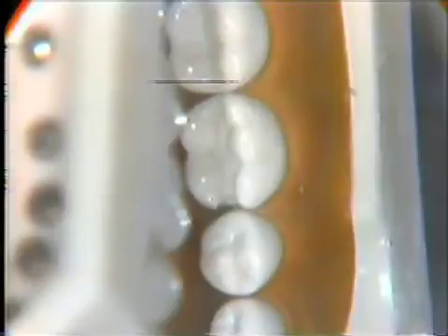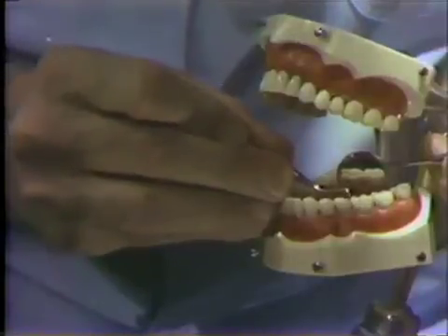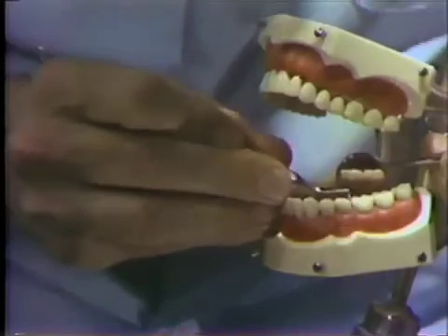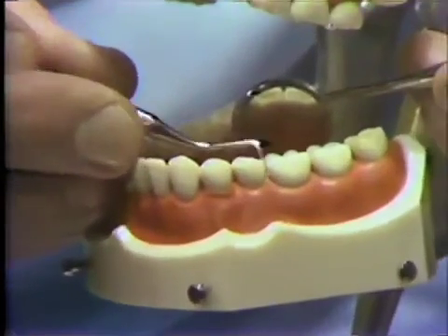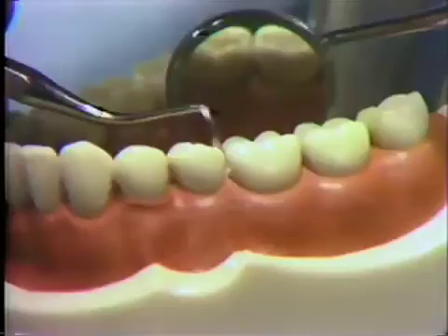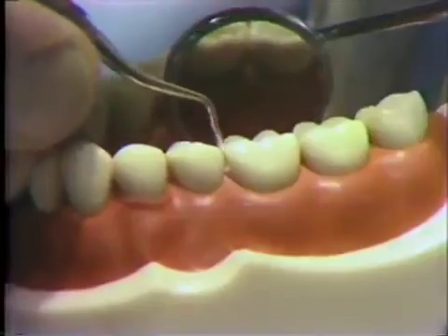With the T1 instrument, the gingival trimmer, we refine the cervical cavosurface area, cleaning up extraneous enamel rods, sliding down the lingual proximal using a lateral scraping action and a pen-type grasp. This is a modified bevel, the intent being to eliminate unsupported extraneous enamel rods.